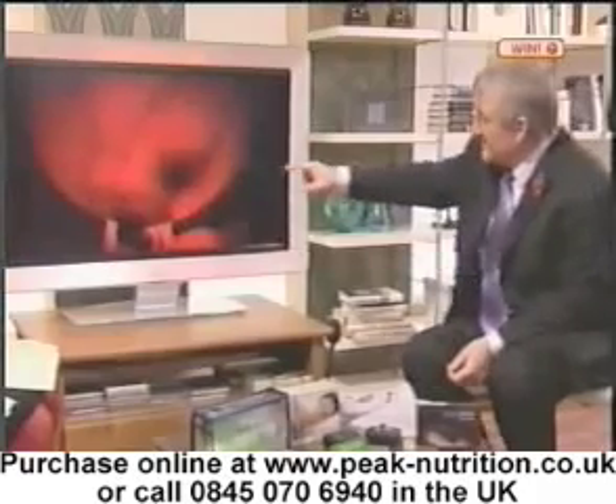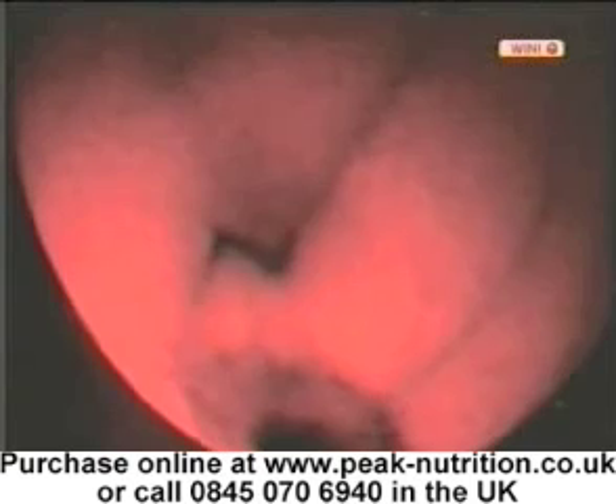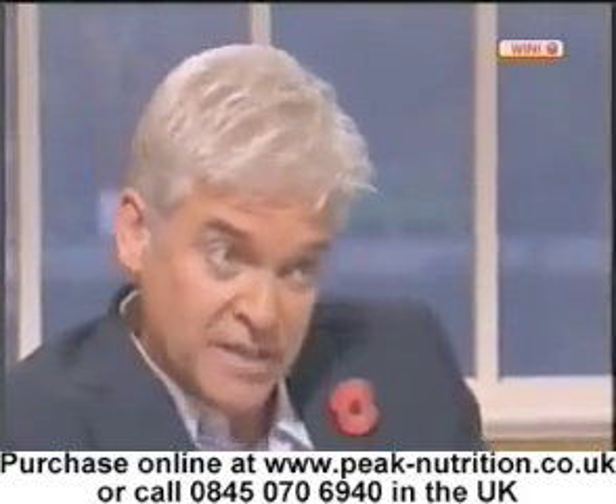See that shadow there? The light is coming through the breast tissue and there's a shadow there, at about the 11 o'clock position. But this in no way should be used as an alternative to going to have your usual scans and going to see your doctor. And not everything that shows a shadow would be sinister — 80% of breast lumps are non-cancerous anyhow.